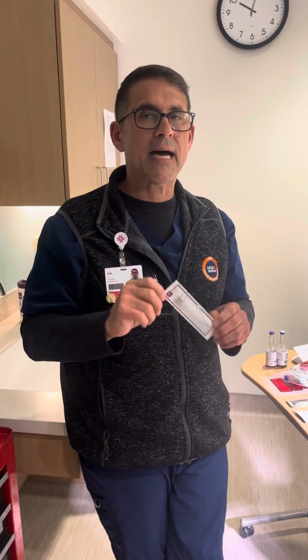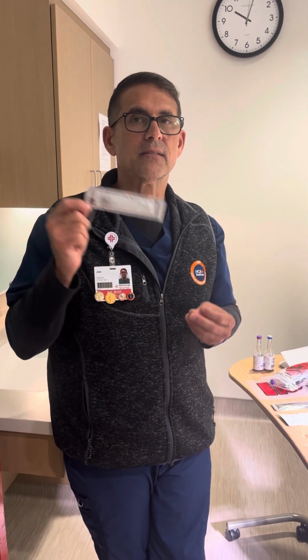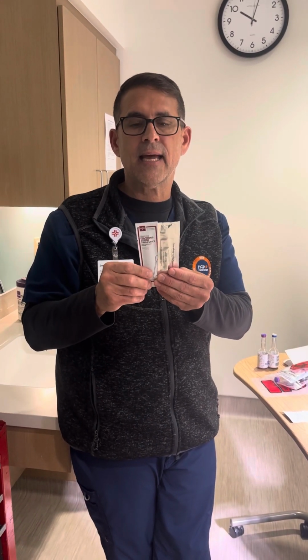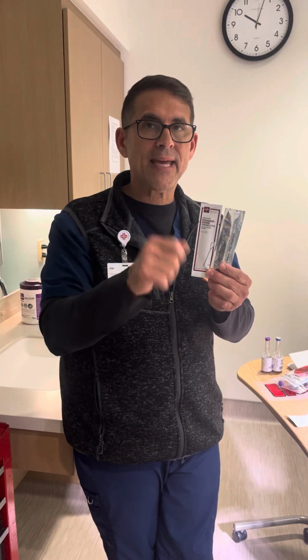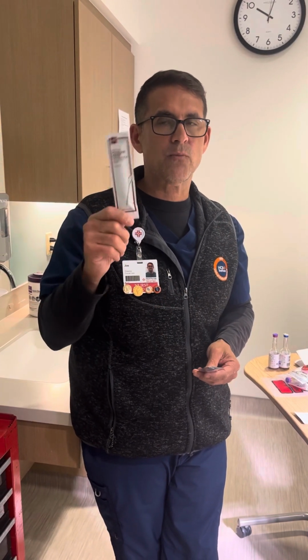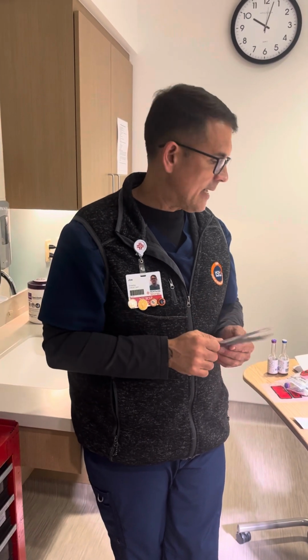But the most important thing about cleaning your site is not how long you're scrubbing it. It's how long you let it dry. Because this and chlorhexidine, they both work by desiccating and hemolyzing the bacteria cells. So that doesn't happen until it dries. If you're poking through chlorhexidine when it's wet, you're literally poking through live bacteria. You have to let it dry. Iodine, same way. If you're poking through wet iodine, it's not doing anything.